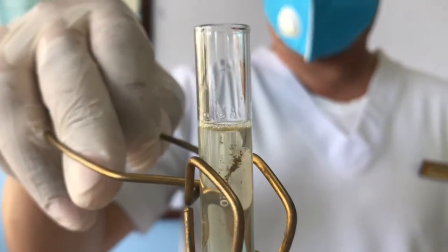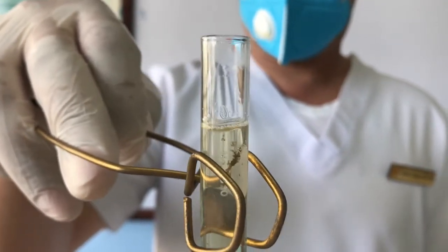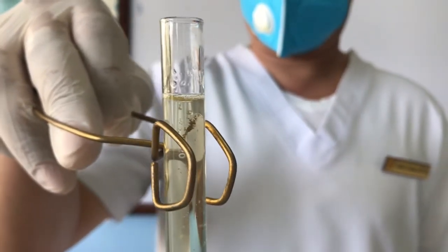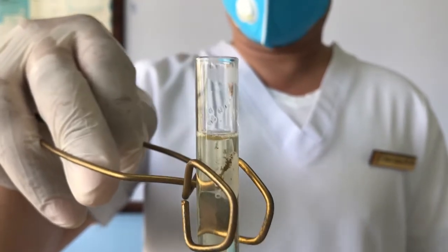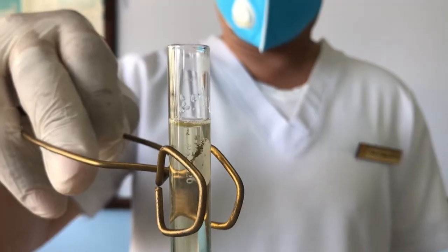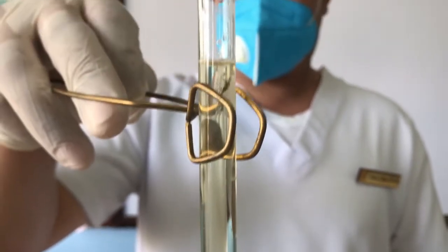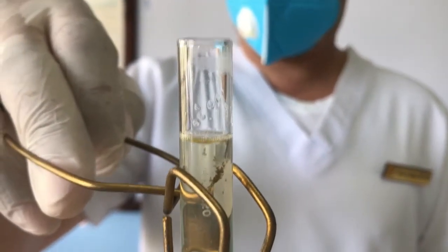For interpretation: no turbidity means negative; slight turbidity means positive 1; moderate turbidity means positive 2; heavy turbidity means positive 3; solid precipitate means positive 4.